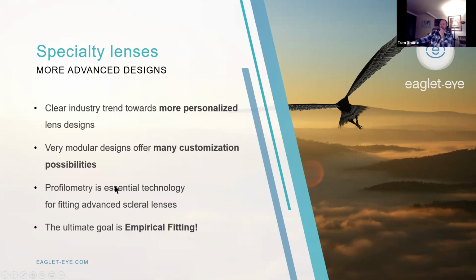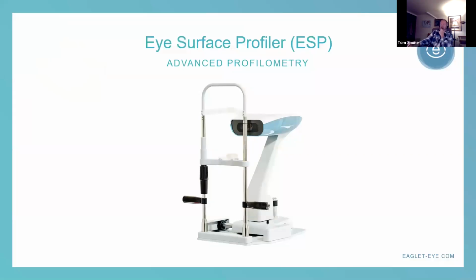I talked about the essential nature of profilometry in fitting scleral lenses. And I talked a little bit about the goal is empirical fitting. So that's our background. I am now going to turn it over to Dr. Tom Arnold.